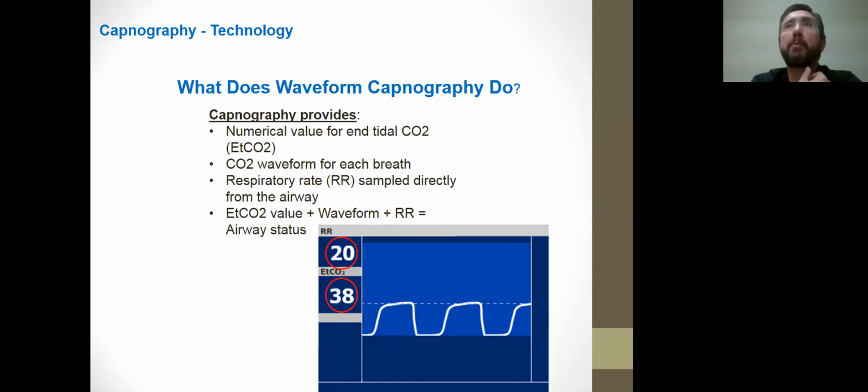Now, conditions such as a pulmonary embolism and congenital heart disease, which affect perfusion of the lung, not necessarily the shape of the curve, may show a decrease in the actual end-tidal CO2 metric value. So it actually greatly reflects the relationship between the two and arterial blood because of the pulmonary artery. And of course, it also is going to measure metabolism. Increased CO2 production is seen during shivering and fever. Reduced production in end-tidal CO2 is seen during anesthesia and possibly hypothermia.